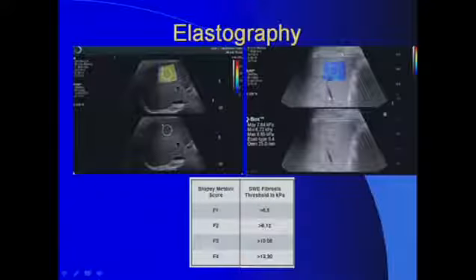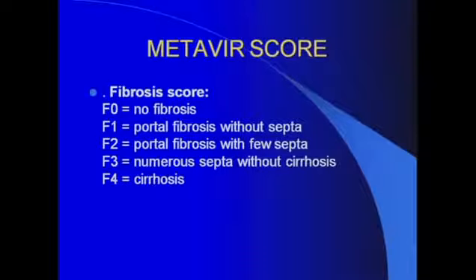Now the system will measure the speed of sound, and will also estimate for you the degree of stiffness based on kilopascal measurements. And this is a very intriguing way and a very promising technique. It has been approved in multiple countries in Europe as evaluation of the degree of fibrosis and potentially avoiding an invasive procedure like biopsy.